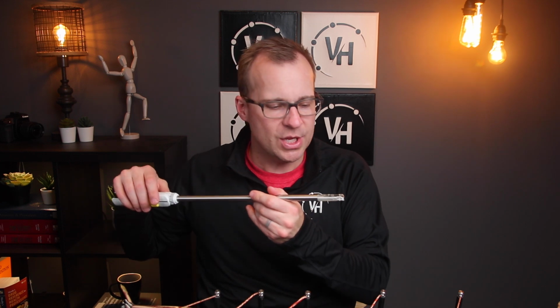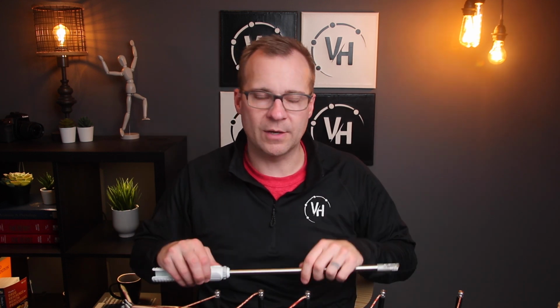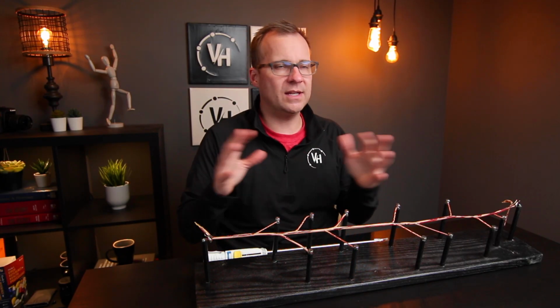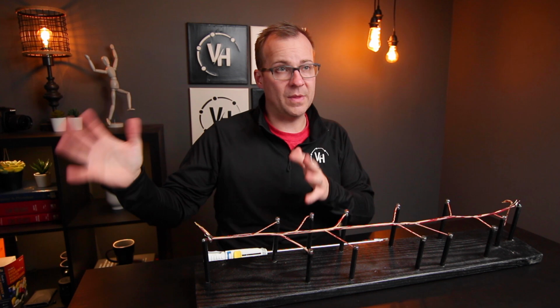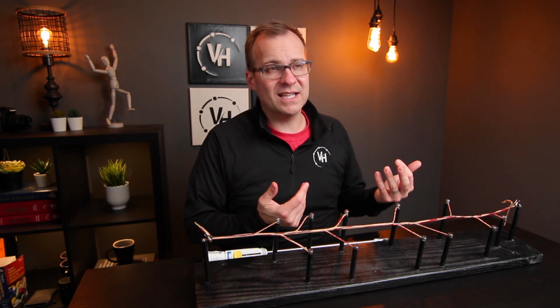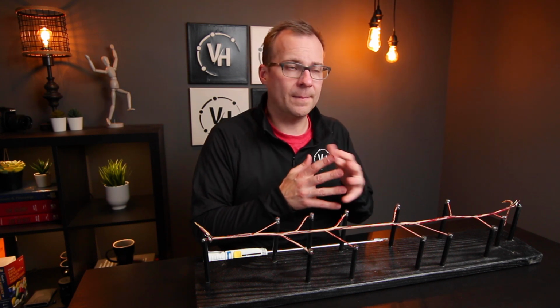It's this huge branch. So I went to cauterize it, and after I was done, I pulled out half of a vein. I was expecting to pull out one long vein, and I pulled out two shorter veins. Now, fortunately for me, it worked out fine. We cut the cauterized part off. We had plenty of vessel from the thigh and from the lower leg, so it was fine, but certainly embarrassing and unnecessary. If I had taken just a little bit more time to get that dissected, it would be okay.